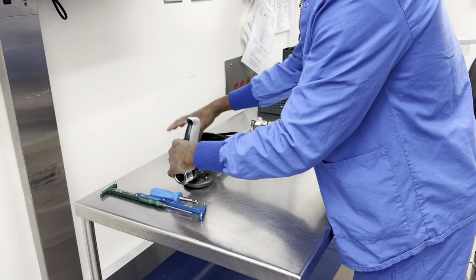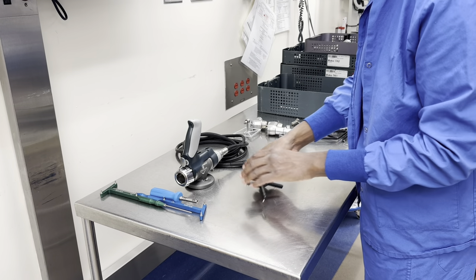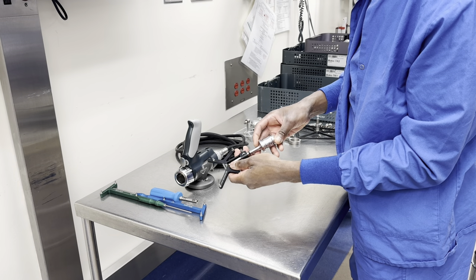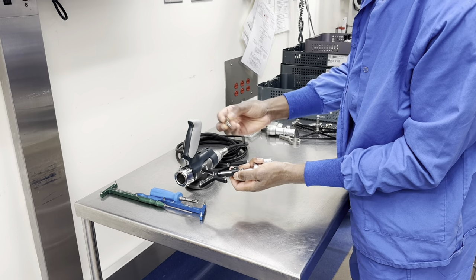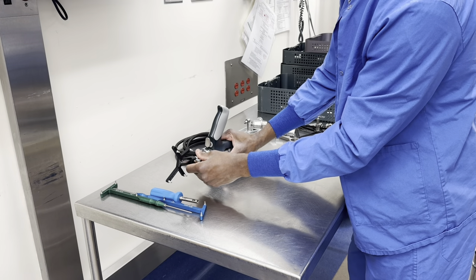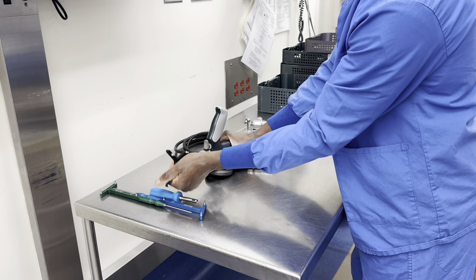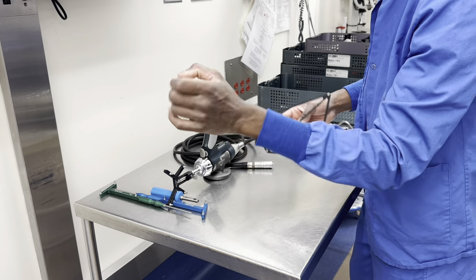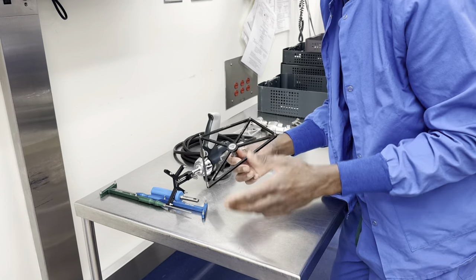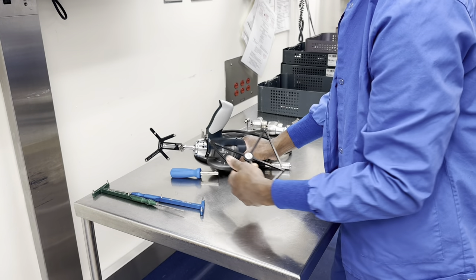When registering the robot, you'll need the end effector array. Just like with the blunt and sharp probes, you push the disc onto it and press it down firmly. To fully assemble it, you put this piece into the hole and screw it in — then it goes onto the handpiece. When the red is showing it's unlocked; turn clockwise to lock it. The end effector array and the base array are what face the camera when you're registering the robot prior to the case.